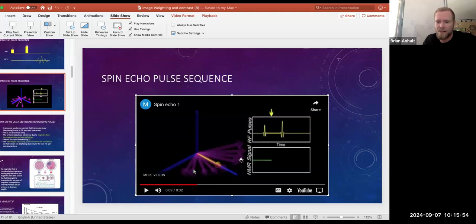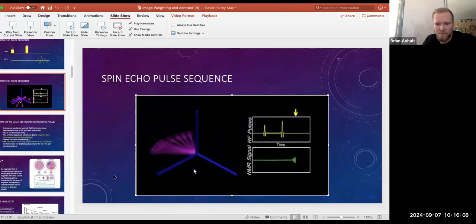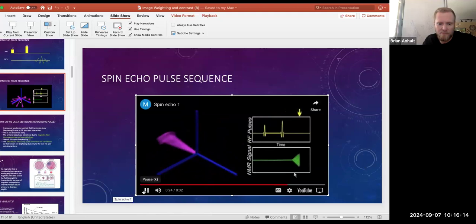So we can see the transverse magnetization is decaying, diminishing. They get out of phase, it tends towards zero, and then we flip around the other way. In the rotating frame of reference, those fast ones catch the slow ones, and there we go. A sort of bada bing, bada boom, they refocus, and we measure now, the signal comes back. So the 180-degree refocusing pulse flips them 180 degrees through the transverse plane.